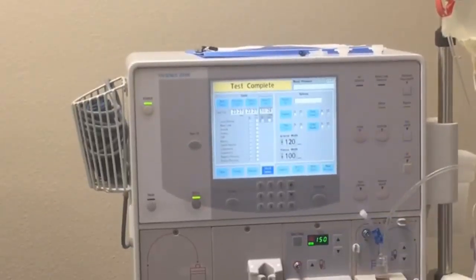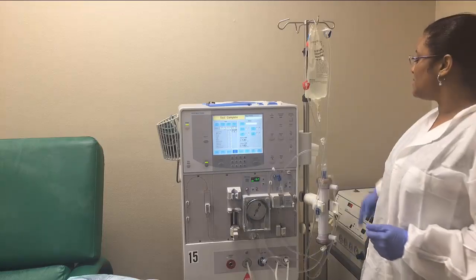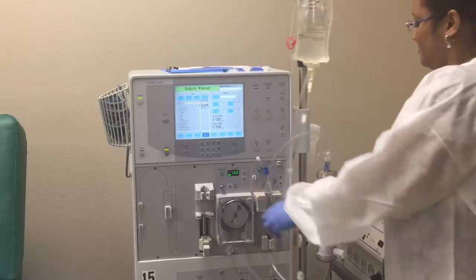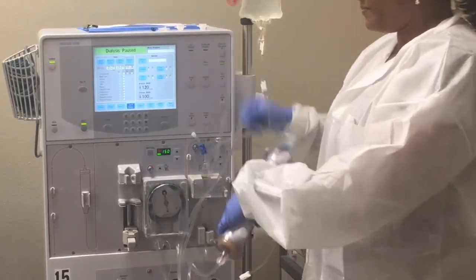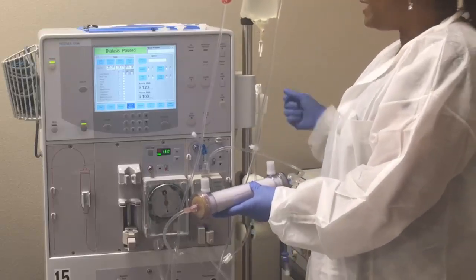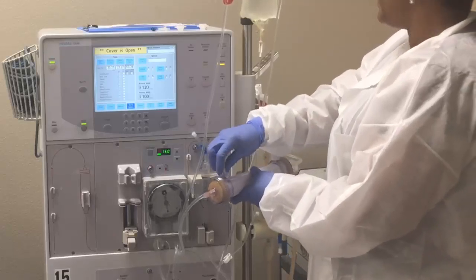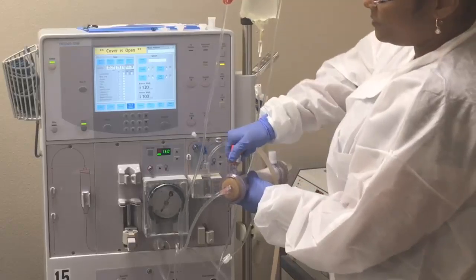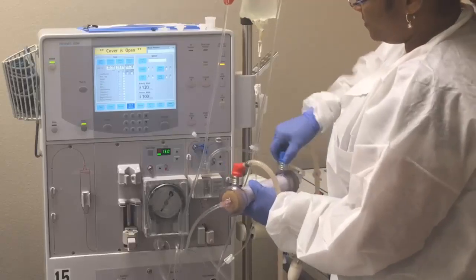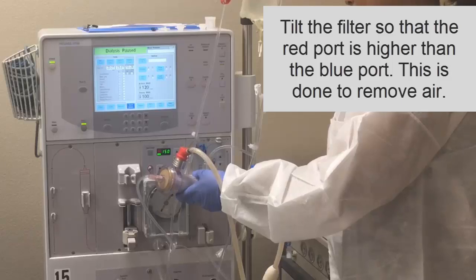So once your test is done and complete and everything passed, now we can go ahead and move on. What we're going to do is click reset, and then we're going to connect the dialysate lines to our filter. I'm going to tip the cords up, open the shunt — and these are the dialysate lines — and go ahead and click reset.